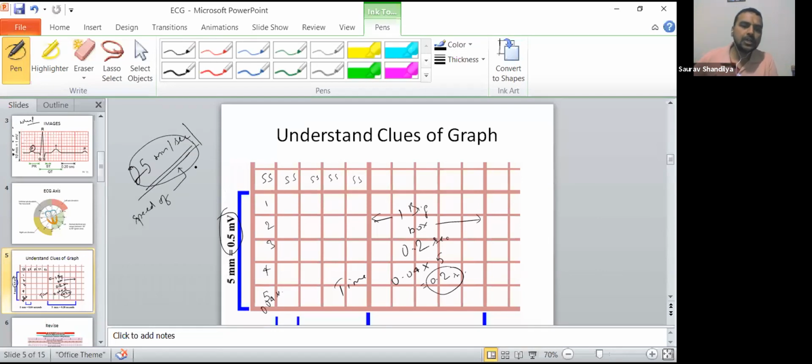As I told you earlier, it was recorded by the pen, but now the paper gets heated at particular timing. Here you find the graph: P wave, then it goes down, then QRS, then it goes prolonged, and then T wave. That is how it happens, because it heats. Earlier it was a pen recorder, now it heats and the paper comes according to the heating. That is the technical part, we will not get into much detail of that. What is important for us, we'll go for that. Now you understood that.